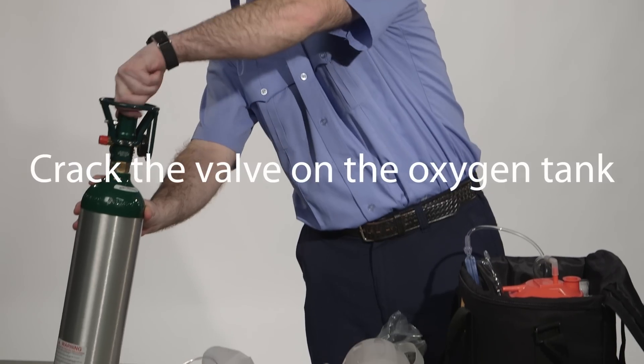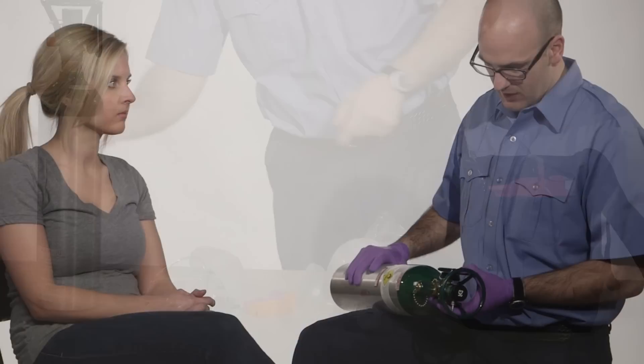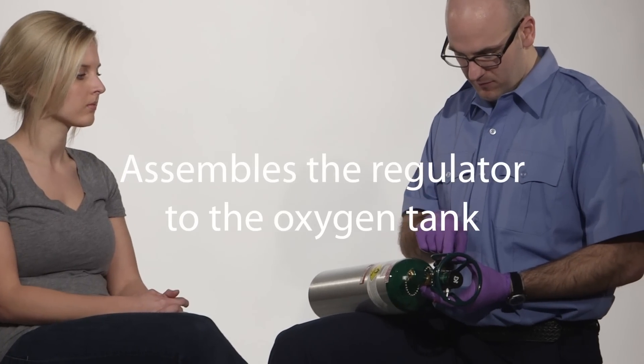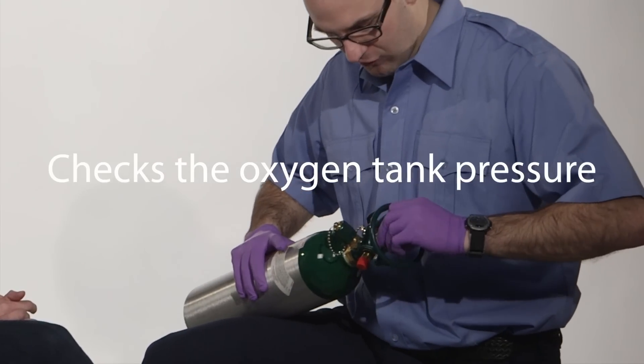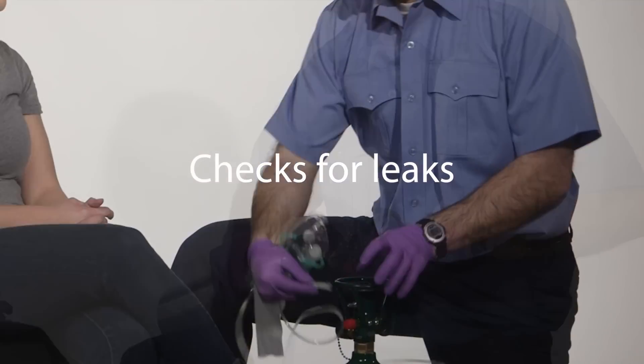Crack the valve on the oxygen tank. Assemble the regulator to the oxygen tank. Open the oxygen tank valve. Check the oxygen tank pressure and check for leaks.